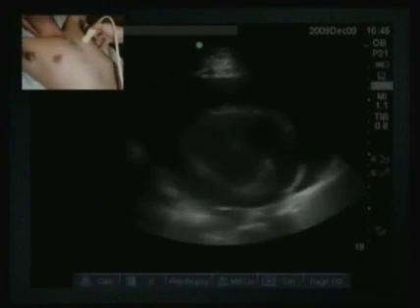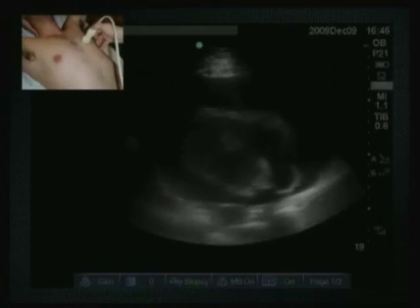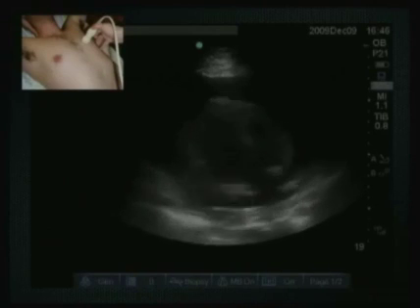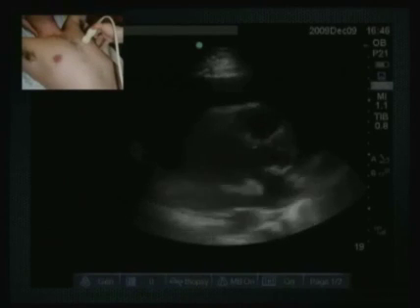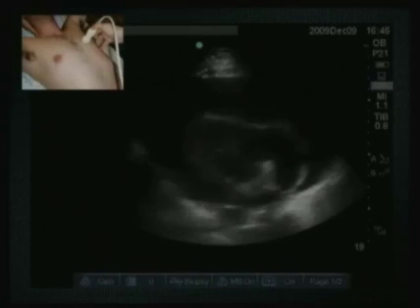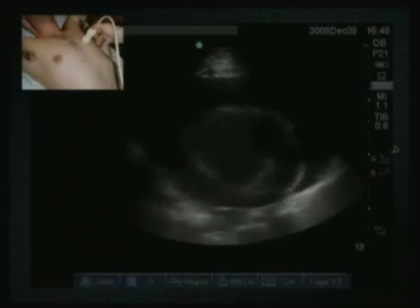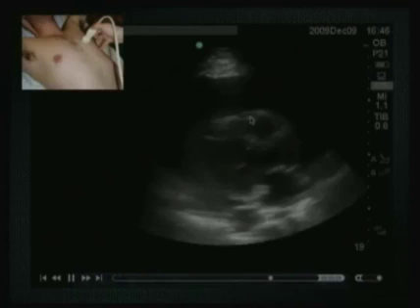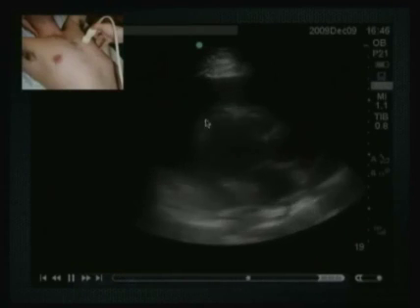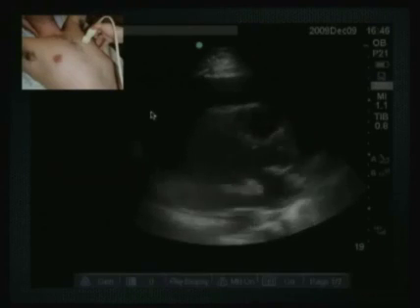When you look at a parasternal view, it's a little bit easier to visualize the free wall of the RV. Again, in this example, there's a lot of movement of the heart, but what you're looking for is impaired relaxation during diastole of the RV. So typically, the RV would relax symmetrically. Whenever there is increased pericardial pressure, it often causes a little bit of a serpiginous shape to the RV free wall, or a little bit of a scalloping pattern. And when you see that, that's often a tip-off to cardiac tamponade.